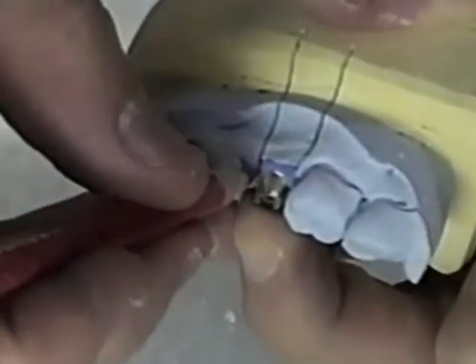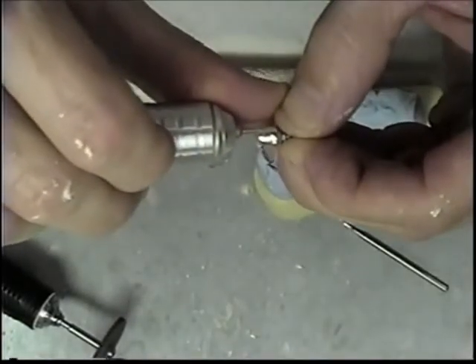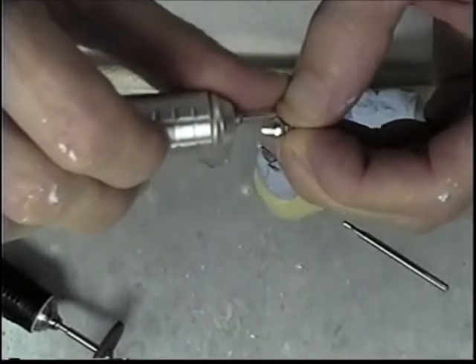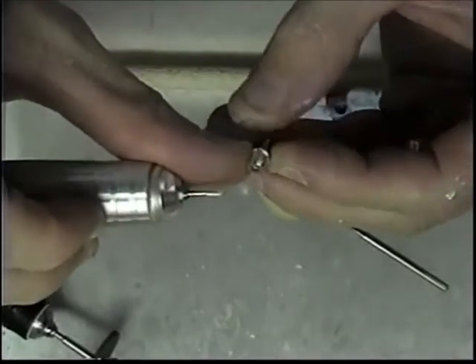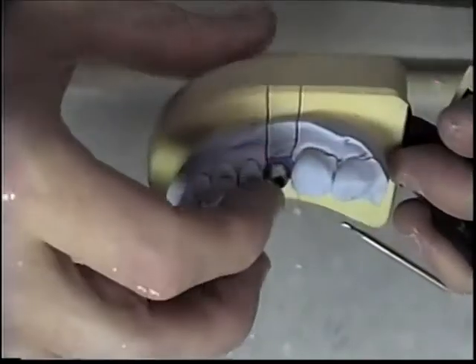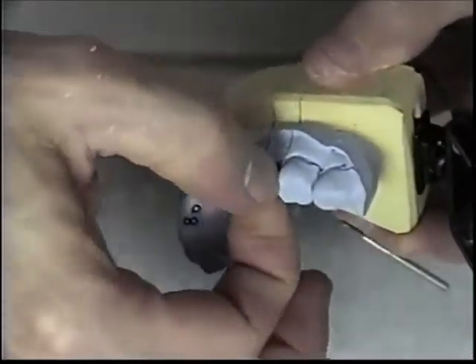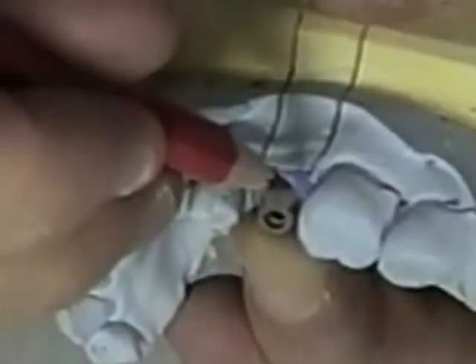Starting to get there. I'll check it and go back for another look. That's starting to look pretty good. I'm going to go ahead and do the distal, the mesial, and the lingual margins as well.